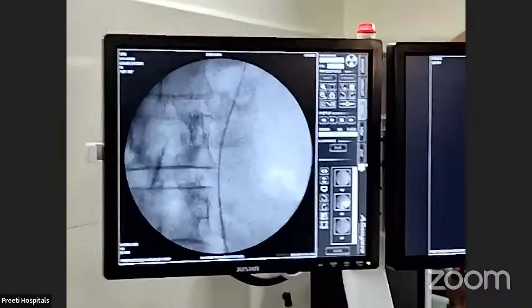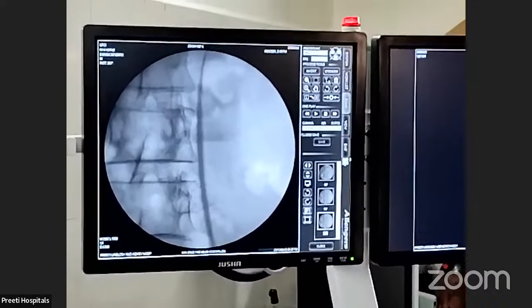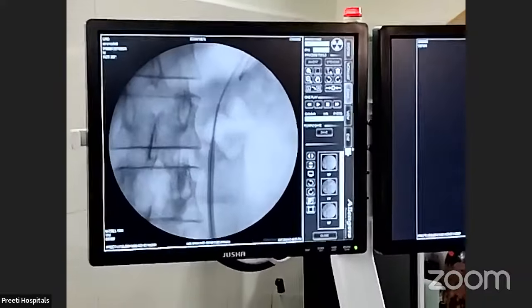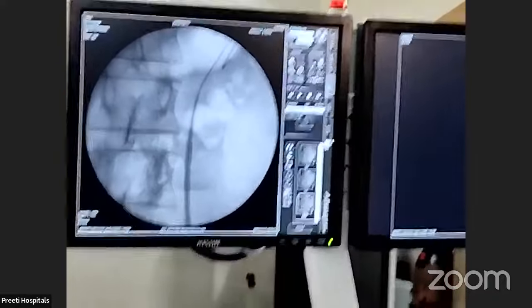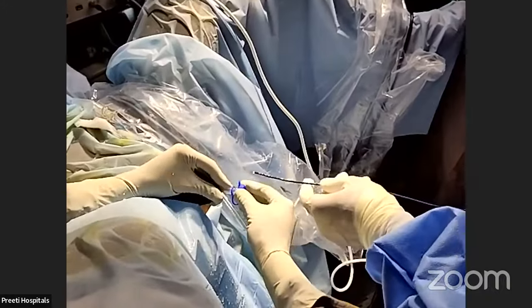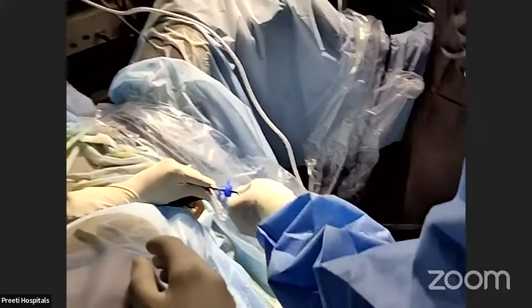Okay. So now I am better off, isn't it? See, now I am removing the guide wire. I will go with the flexible scope. Almost completely I have gone in, just below the PUJ. But if you don't cross, he is a tall person.